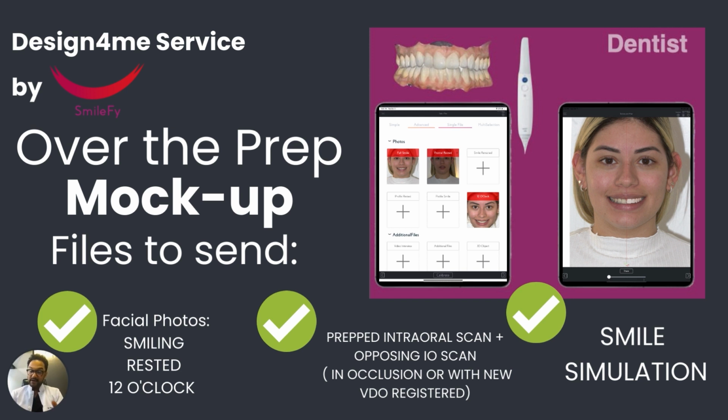If you have the original STL prior to prepping, that will also help the smile designer design it for you. Also, send a smile simulation with a simple picture, so the smile designer has a better understanding of the teeth proportion and teeth shape, as well as the height.